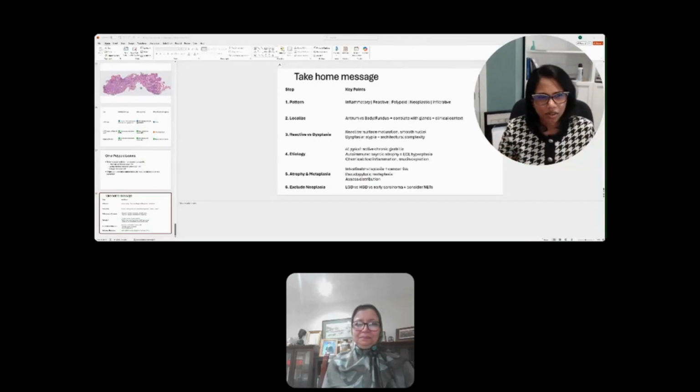Certainly when they query Helicobacter pylori, it is important that we exclude it. Sometimes it's ubiquitously written on forms, and you think, okay, this is just like exclude celiac, exclude HP gastritis. But when there is a degree of inflammation, usually moderate chronic inflammation, and it's looking a little busier and a little dirtier, and I can't find them, I would do it.